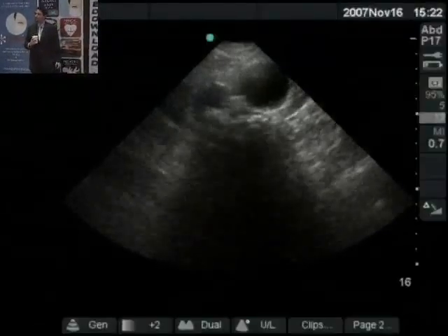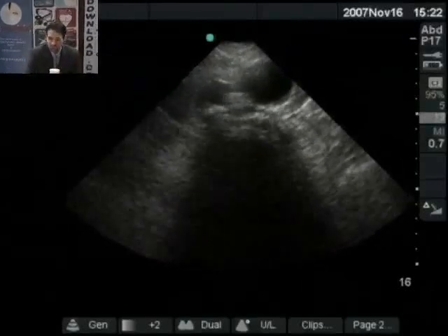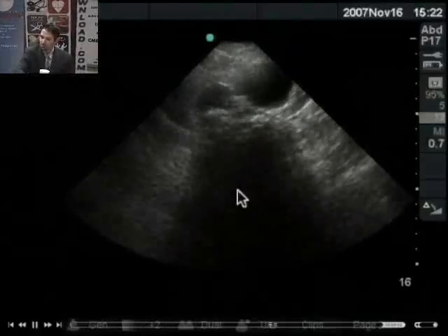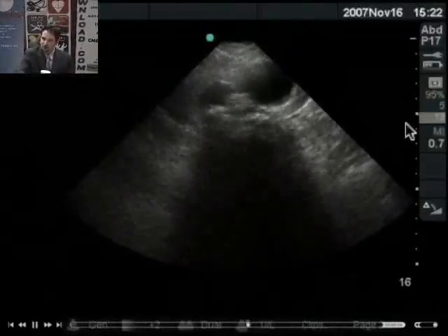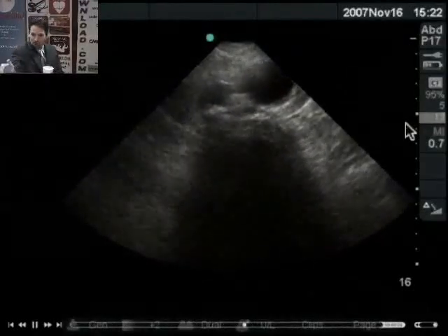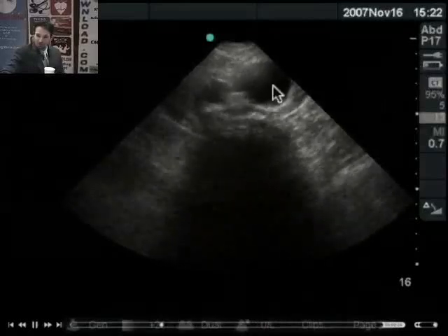This is scanning a little bit lower down. Okay, so now we just have a vertebral body to orient us, which is shown here. You just see the anterior part of it. It's solid bone, so it's going to cast a broad shadow beyond it, which is here. Look directly above it, and you've got this gigantic structure here fixing to explode, and that would be a AAA. You can estimate the size, even though it's not measured on this video clip, by these hash marks here. So each one of these is a centimeter, so this is 3 to 4 centimeters.